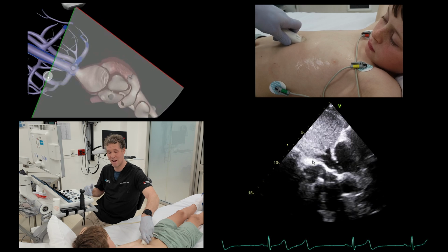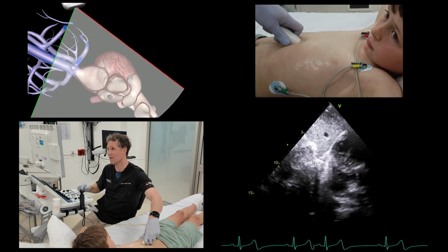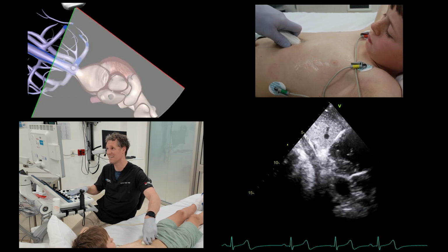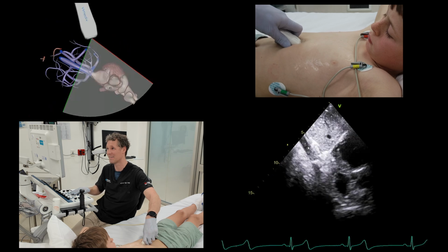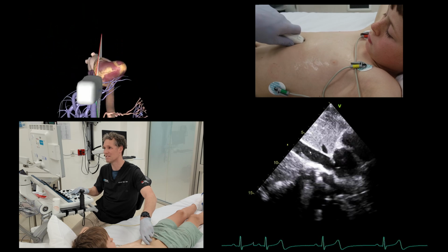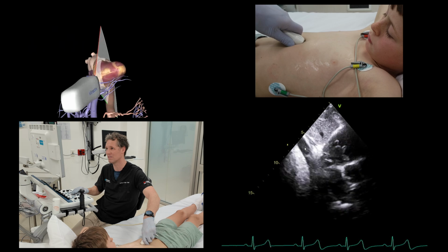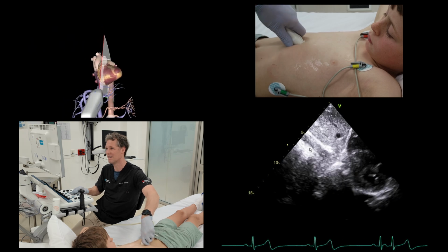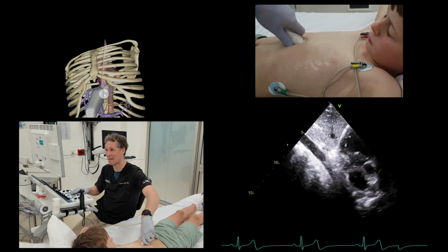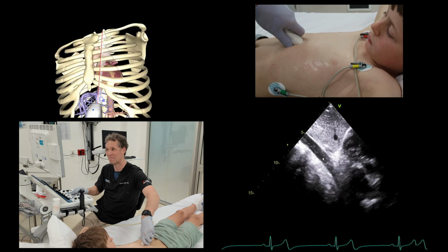If we carry on fanning over now to the other side, we get an idea of finding the aorta. So that's this structure that's sitting in here. And that aorta's got a pulsation to it, so we get a slightly better view. Where is it? There's our IVC. Look over to the patient's left. There's the aorta. It doesn't enter into the right atrium, obviously. It doesn't have hepatic veins coming off it, so don't get it confused with the IVC.